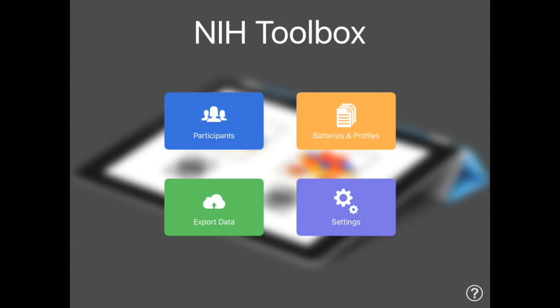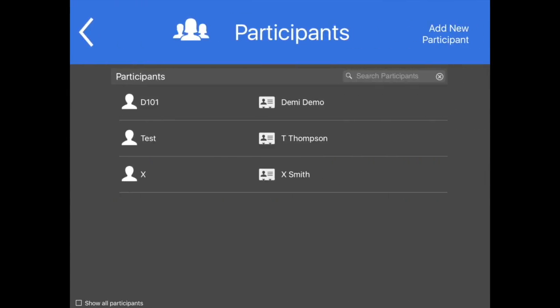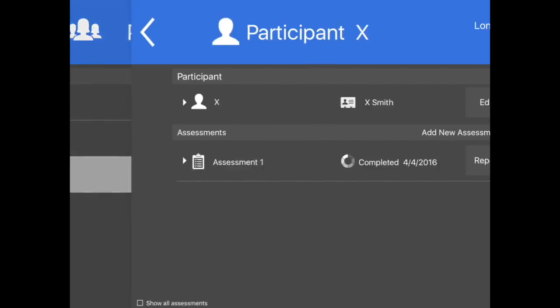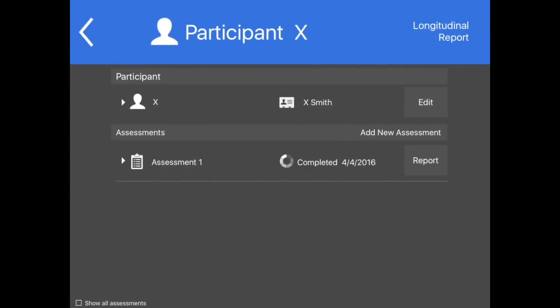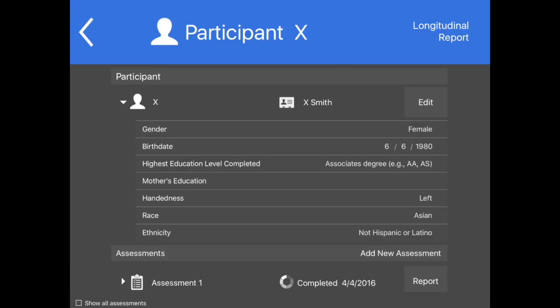If the participant was previously created using the NIH Toolbox app on this iPad, you may also locate him or her by tapping Search Participants at the top right corner of the black part of the screen. Once the participant is located, tap their identifier or name to open their record. Tap the arrow to the left of the identifier to view or edit the participant's information.